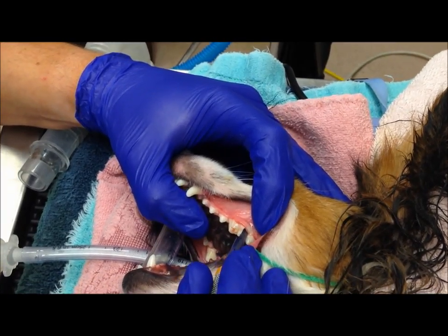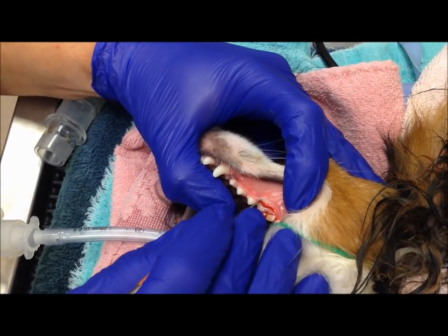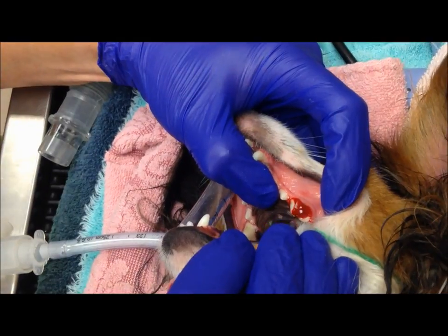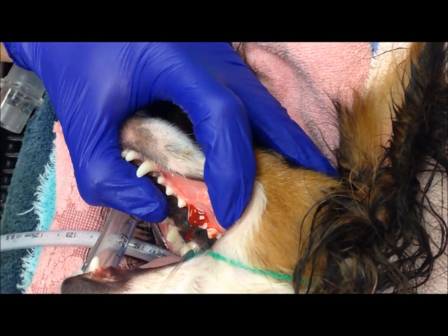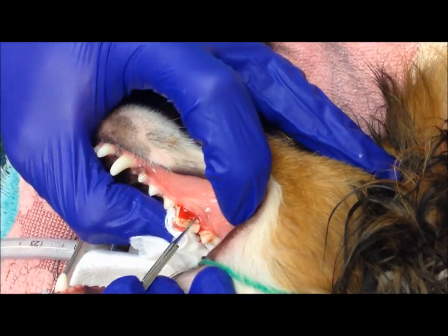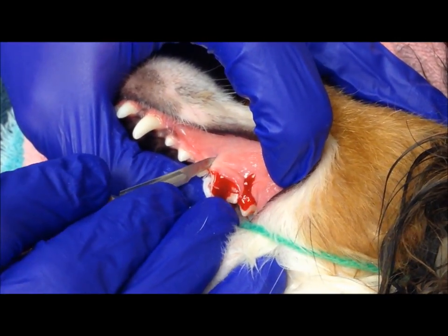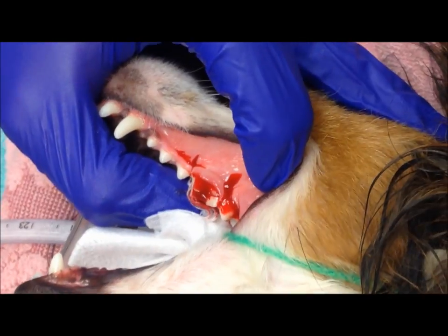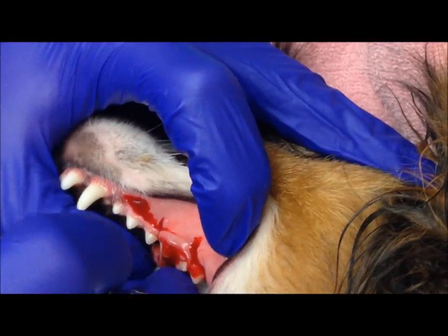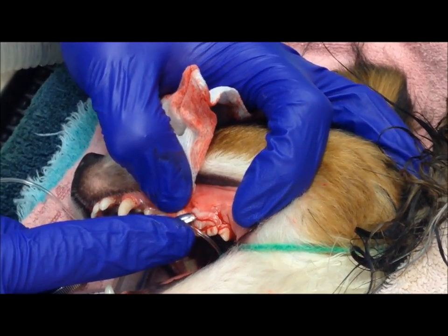I'm cutting the attachment of the gum tissue to the tooth itself with a scalpel blade. Next I'll make two incisions along the side of the tooth to make my gingival flap. Now I'll be elevating that gum tissue to make the gingival flap.